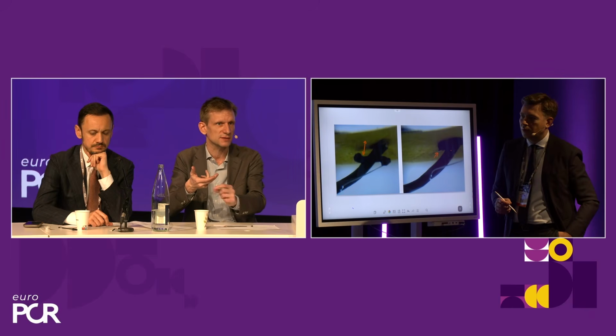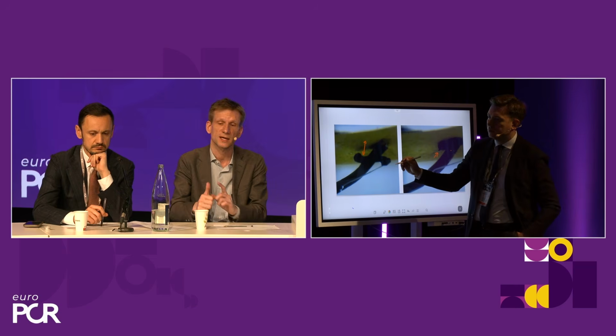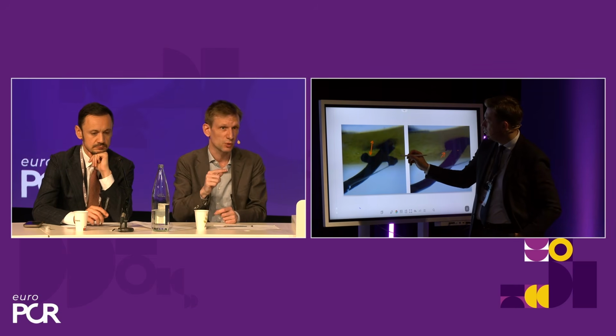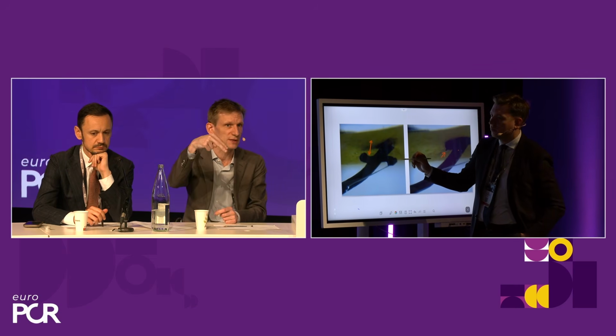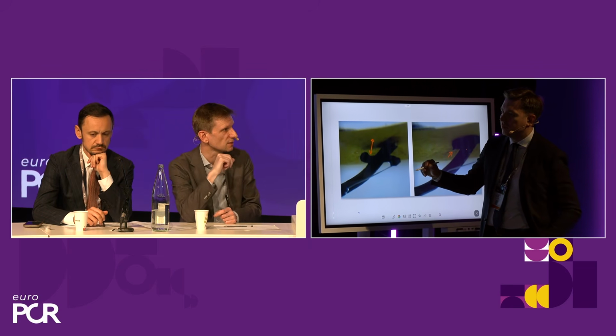And the risk is that if you deploy your needles, you will have a failure. So it's better not to shoot your needles, bring it back down on the anchor and repeat the maneuver again until you have pull back. And with the pull back, you should strictly not see any pulsatile side bleed. If you deploy anyway, you risk all kinds of complications. Either you have a failure of your device, or in the worst case, I've seen this happen, you shoot the needles into the posterior wall. And then you can get some other tricky complications.